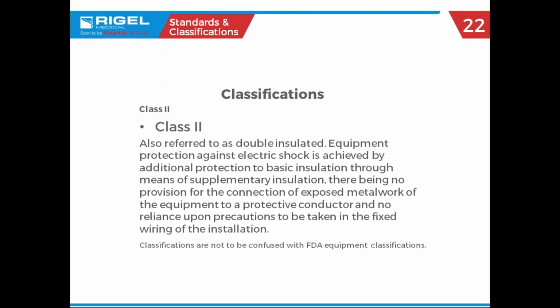Some manufacturers would take copper foil and wipe it over the housing of the instrument to look for any potential leakage currents. But we'll see what the differences are that were introduced, I think, in 2015 with Class 2 classifications and the amount of testing that's required now from the NFPA standard.